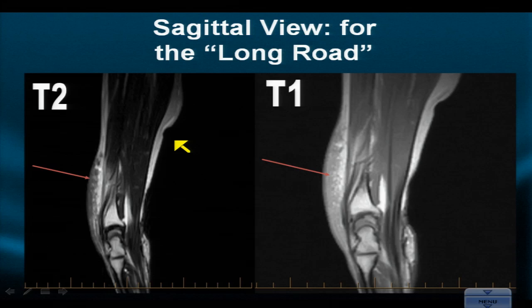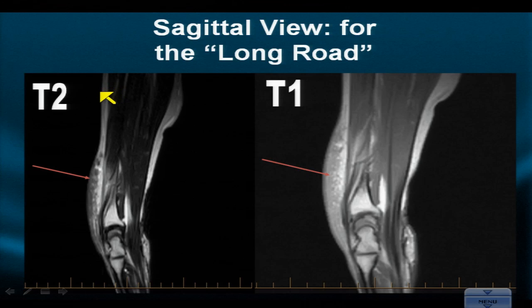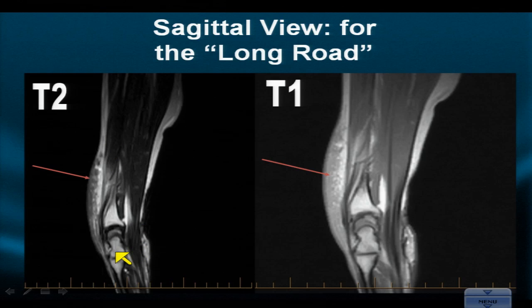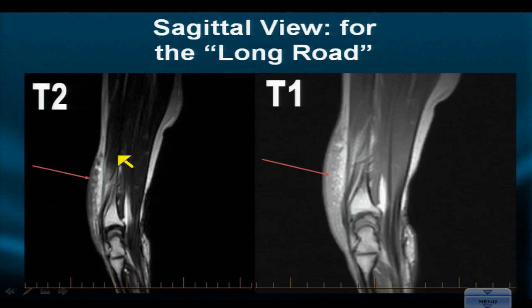The sagittal view is not the primary sequence in wrist imaging, but any time you have pathology that rides along a long structure like a tendon — which runs all the way from the elbow down to the wrist — and you want to see length, retraction, or alignment, you resort to the sagittal projection. This particular case shows an area of induration, inflammation, and cellulitis on the water-emphasized T2-weighted image, though without fat suppression the true extent of edema is not as well seen as it would be on a PD SPIR. Skin thickening, induration, and infiltration of fat are apparent on the T1-weighted image.